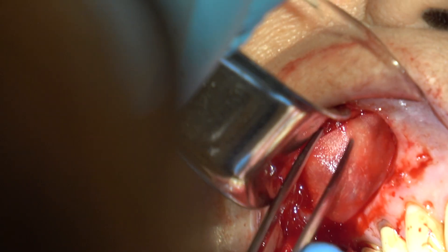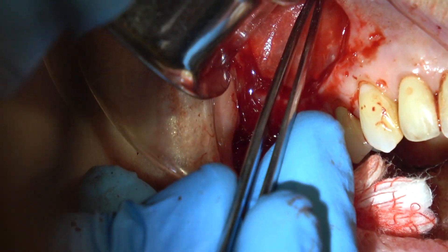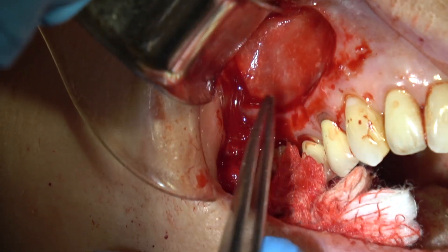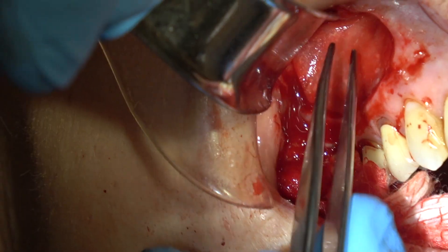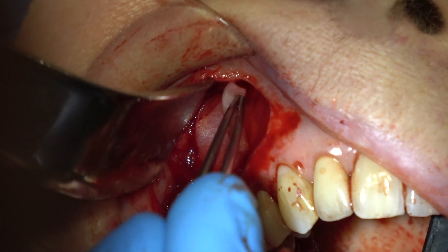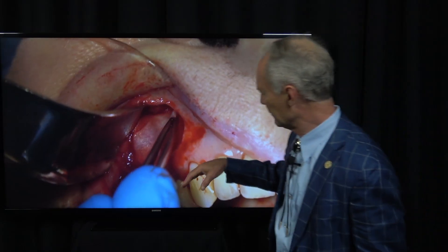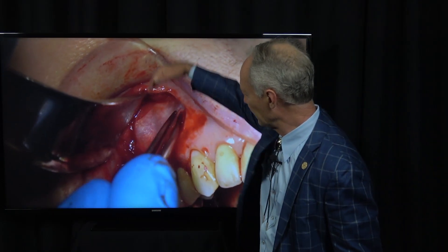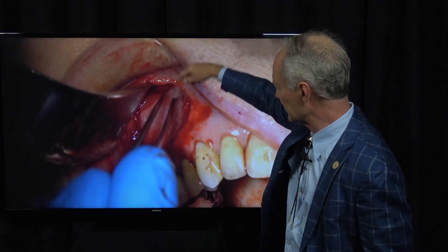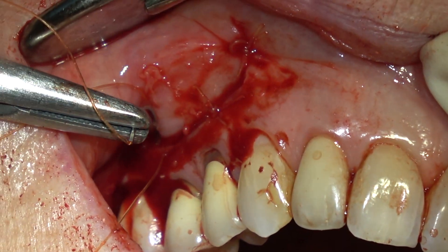I really like Contour Adapt collagen resorbable membrane because it's very malleable. When you wet it, it adheres to whatever surface you place it on. You soak the membrane in sterile water and then place it over the bone graft material in the lesion. It blocks the soft tissue from outgrowing the bone. Very important to place that resorbable collagen membrane. This is such a large lesion I decided to place two resorbable collagen membranes. This is not a hard procedure — just take your time, reflect enough flap, and make a large enough hole to have access to the total lesion.